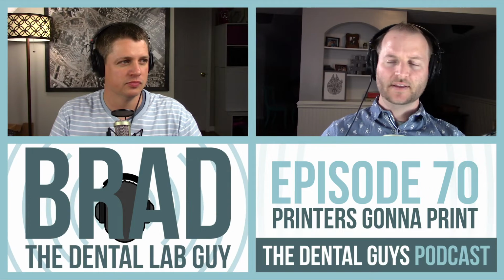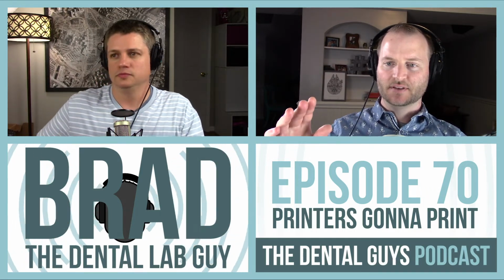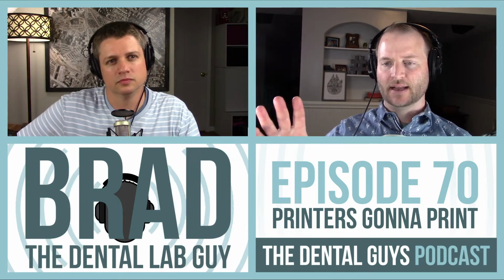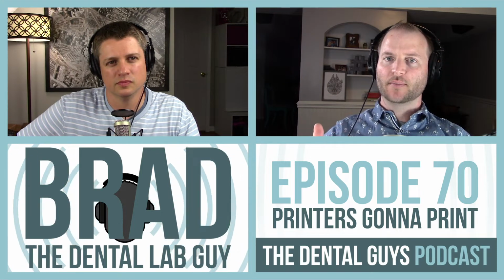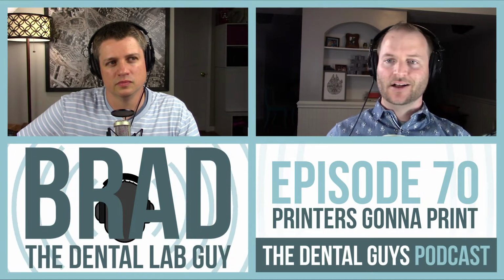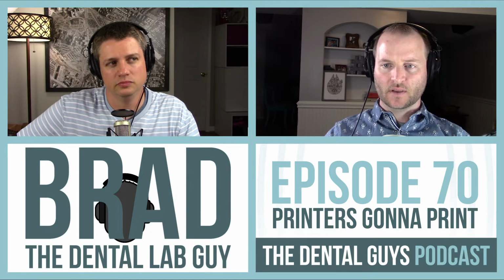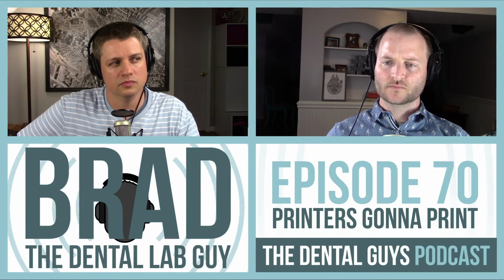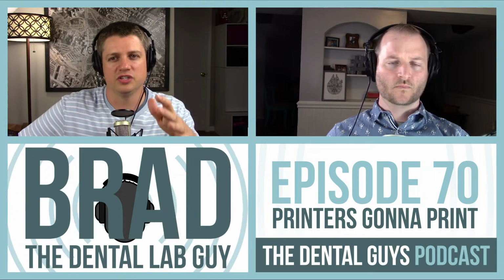So, but well, I think that puts it to sleep, though. I mean, you're saying, hey, I trust the model. Absolutely. Obviously, you're not saying I trust every 3D printer in every office or every lab. I get that. But you're saying properly tested, properly vetted, properly set up, that the technology is at the point where you can say, yeah, this could replace stone in your lab, for instance, the single unit crown type of situation. If it's the right technology and it's calibrated and handled properly with the right engineers, yeah. Yes, absolutely. Let's just go down this route.